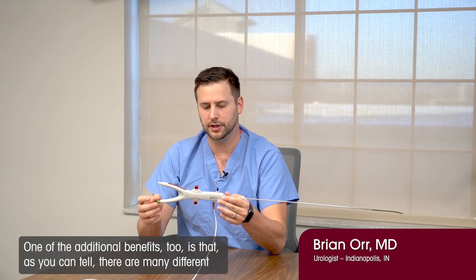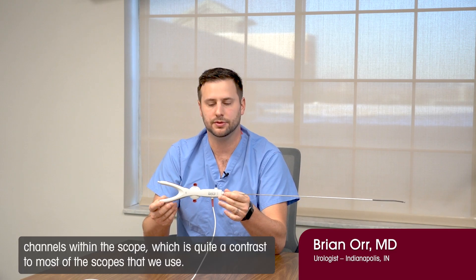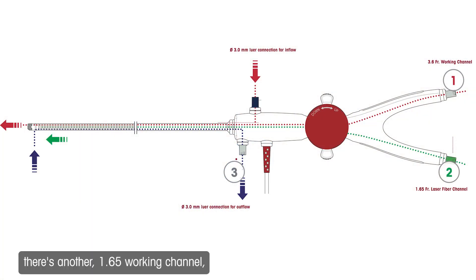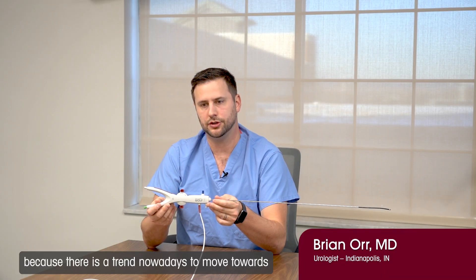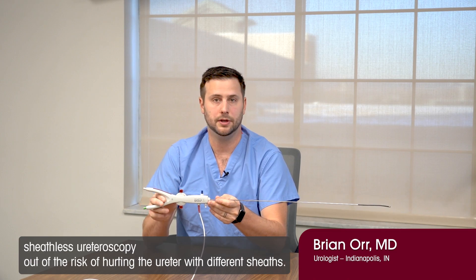One of the additional benefits is that, as you can tell, there are many different channels within the scope, which is quite a contrast to most of the scopes that we use otherwise. There's a 3.6 French working channel, there's another 1.65 French working channel, there's the inflow, and there's also an outflow.